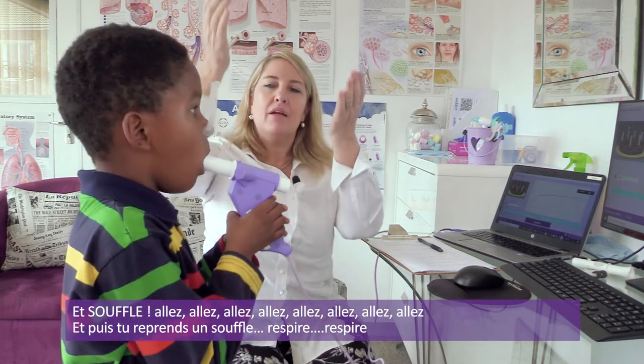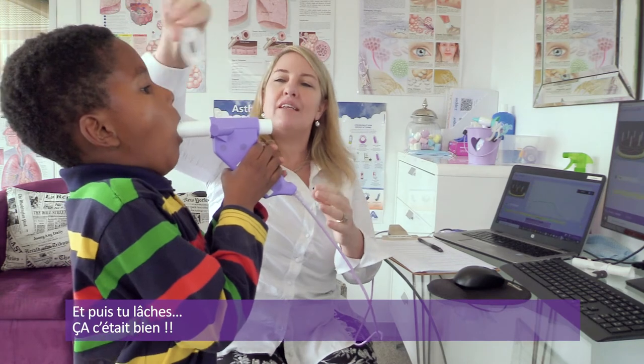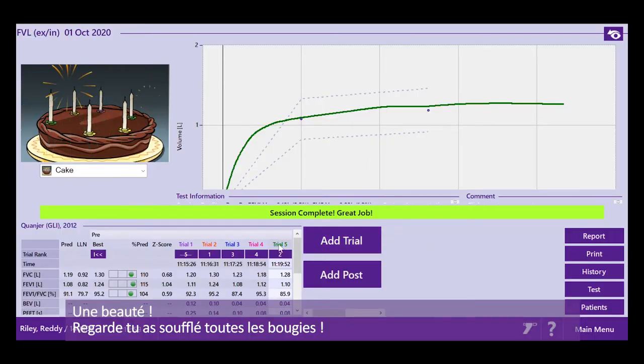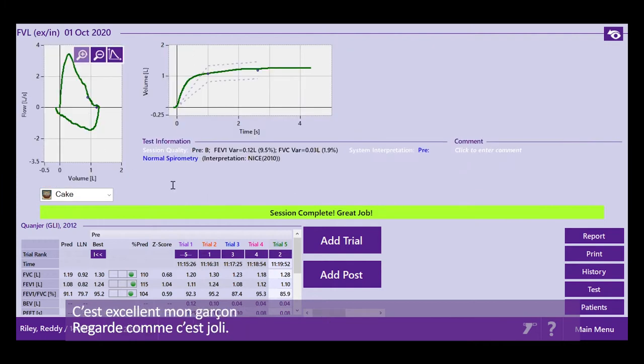And breathe in. Good. And relax. That one was good. Give me five. Good. Well done. Beautiful. Did you see that? You got all the candles out. Excellent, my boy. Look how nice that one is.